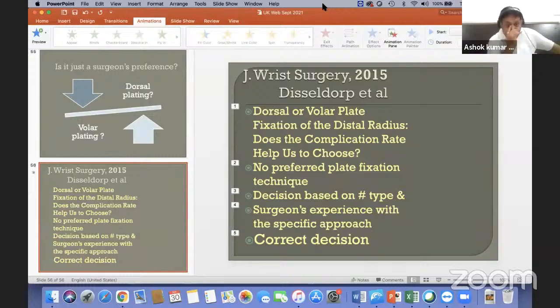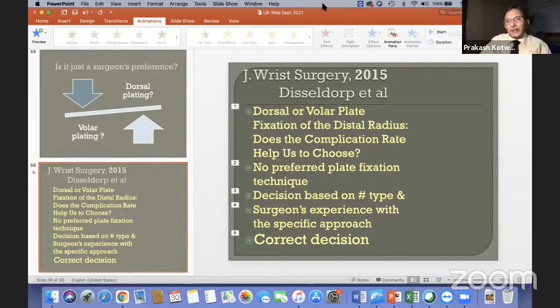So this is definitely an important point, and you should be able to suspect a scapholunate dissociation if on that X-ray you see a slightly increased gap. It may be a very subtle gap. It may not be like a classical Terry Thomas sign. A very subtle gap increase.